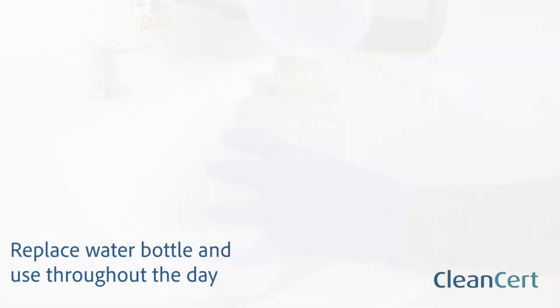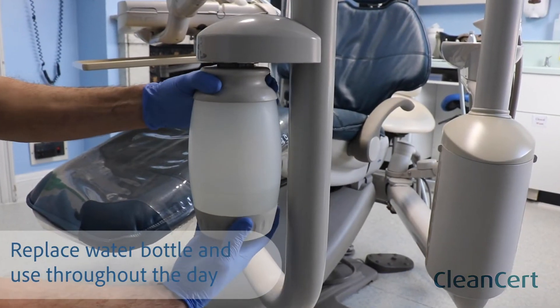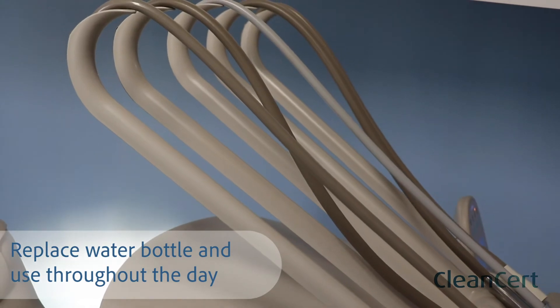Replace your water bottle, draw through the diluted CleanCert and use continuously throughout the day in your water lines.